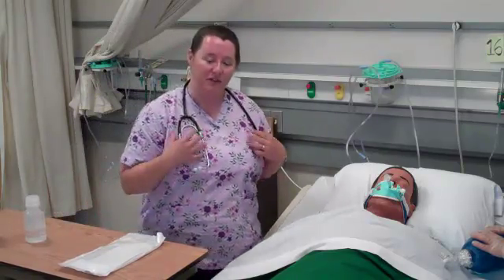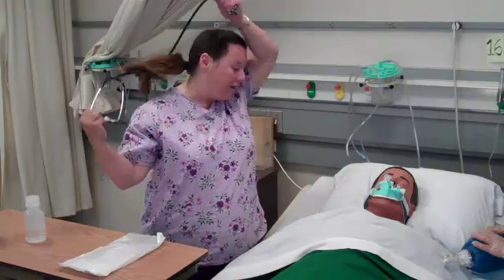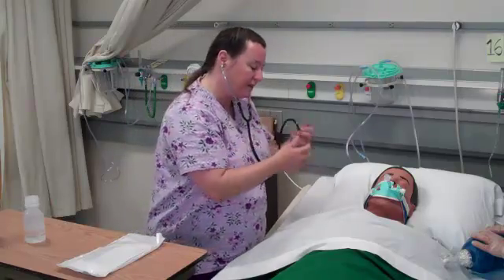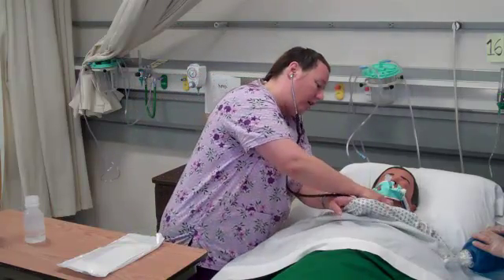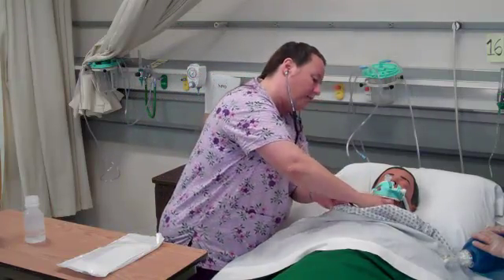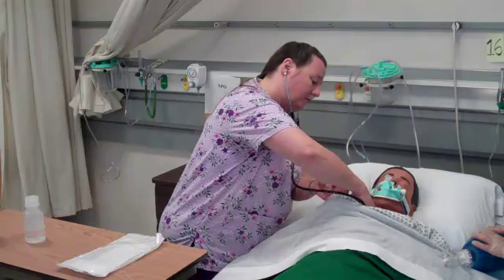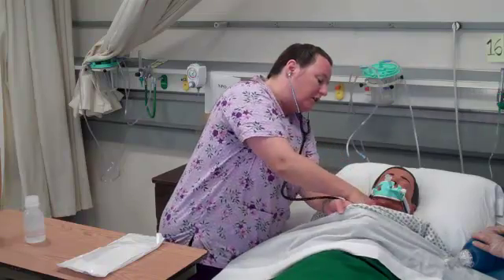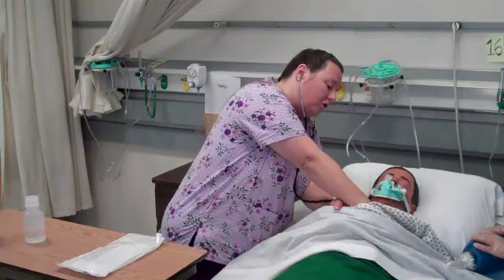Before I do any kind of procedure, I want to make sure I assess my patient. I'm going to use my stethoscope to auscultate for his breath sounds. I'm hearing adventitious sounds — I can hear rales, I can hear rhonchi, I can hear coarse breath sounds.